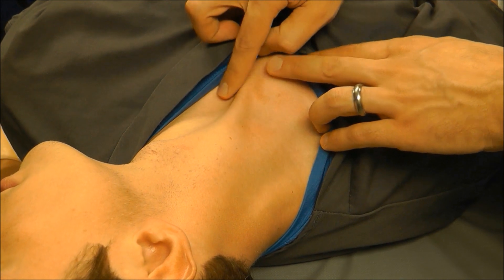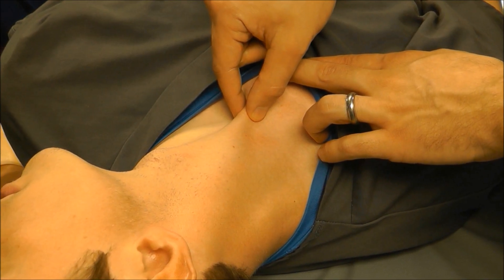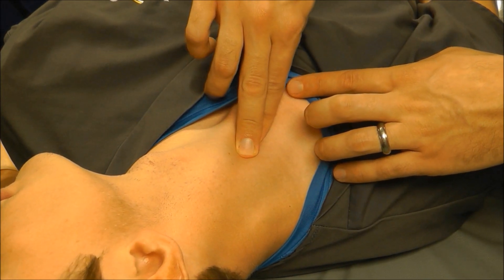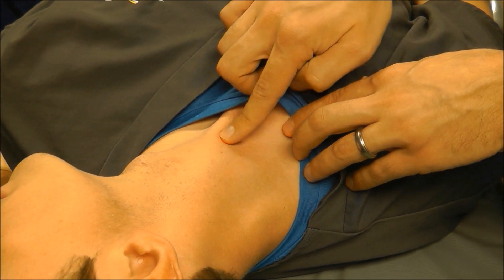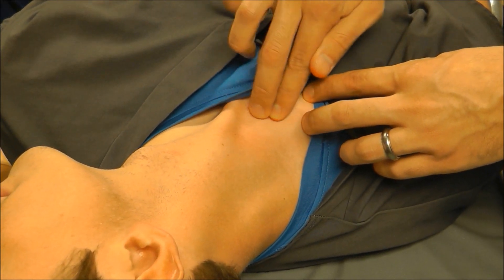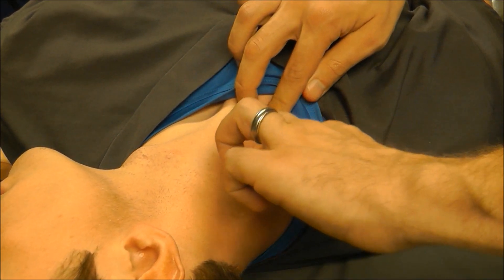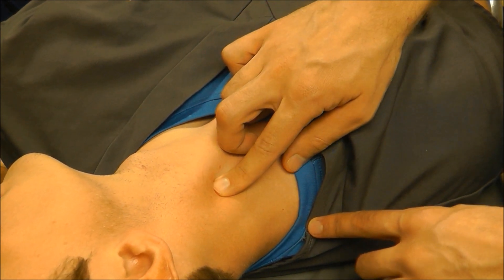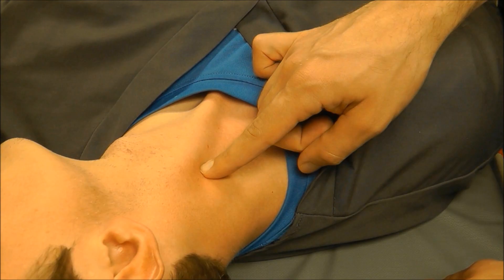Once his head is turned to the left, here are my landmarks. I go right to the sternal notch, and then there's this muscle just to the right of the sternal notch — that's the anterior head of your sternocleidomastoid. Then there's a little groove before you see this other muscle — that's the lateral head of your sternocleidomastoid. You can think of these two as making two sides of a triangle with the base being the clavicle. You follow this up until these two muscles come together at the apex of the triangle — that's the insertion site.